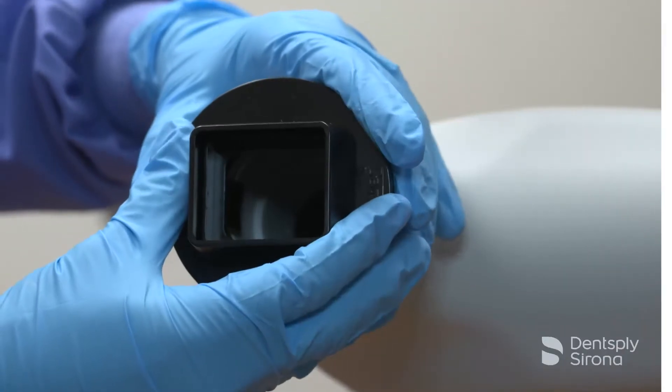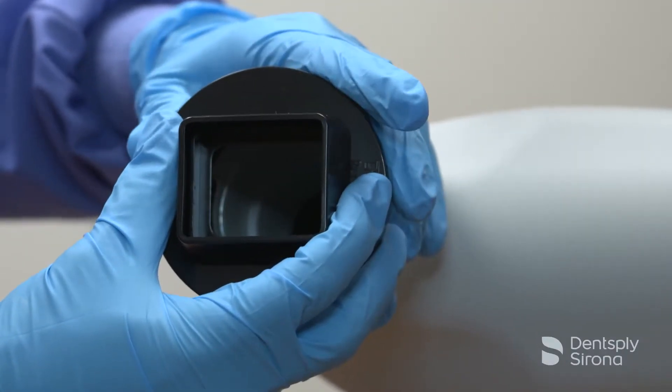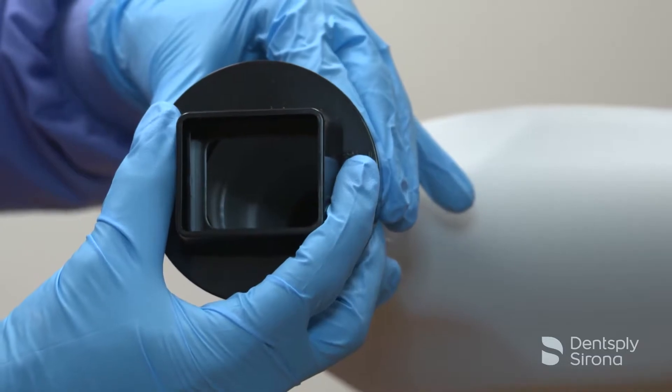To remove the RIN universal collimator, squeeze the inner legs towards the center of the unit until you can pull out the outer ring.